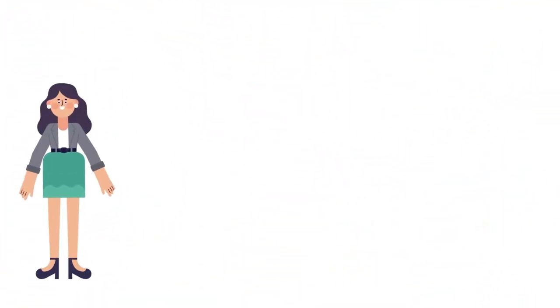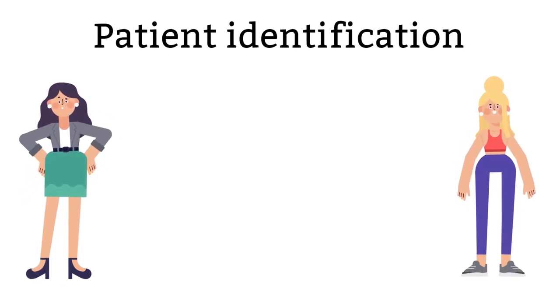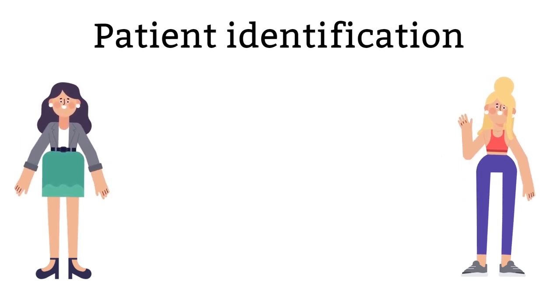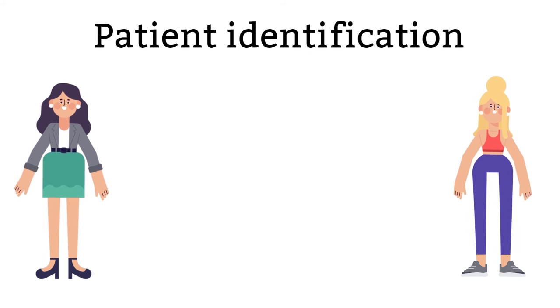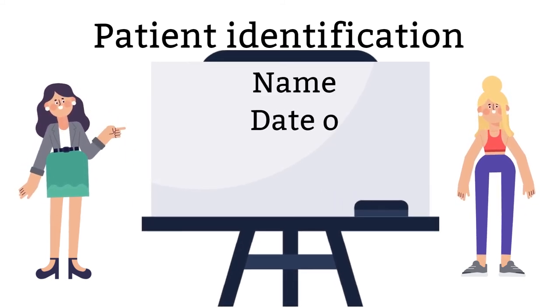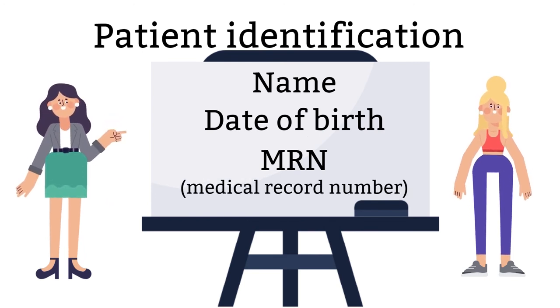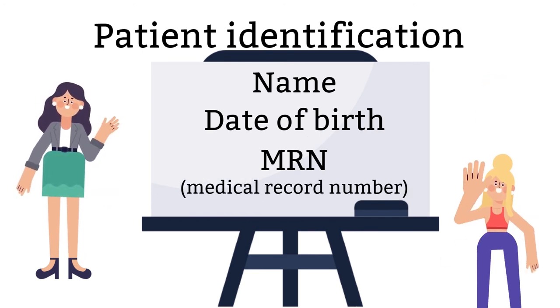After you have identified yourself, you will have to identify the patient. Correct patient identification is the key to patient care. Wrong identifications can lead to wrong diagnosis and treatment. Ask the patients for their full names and date of birth or medical record number. Do not forget to check the patient armband if you are drawing an inpatient.